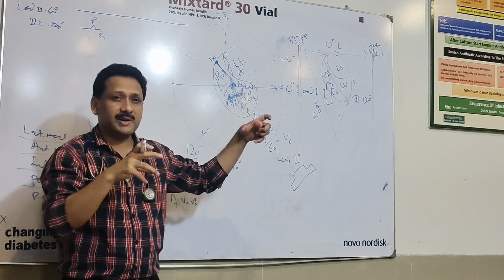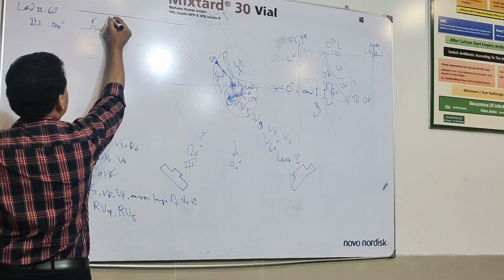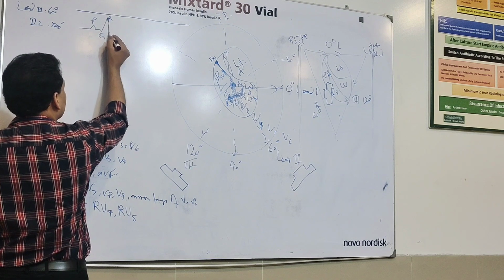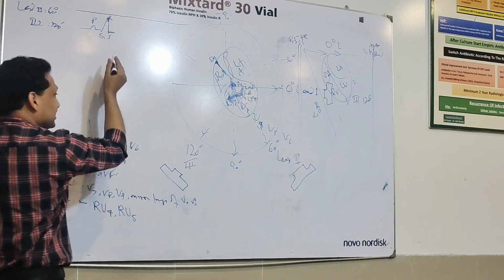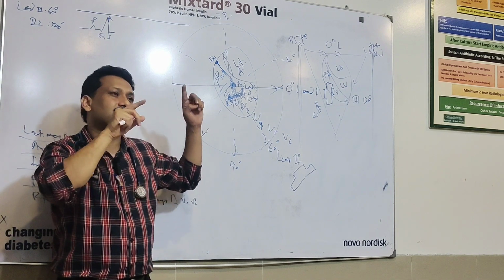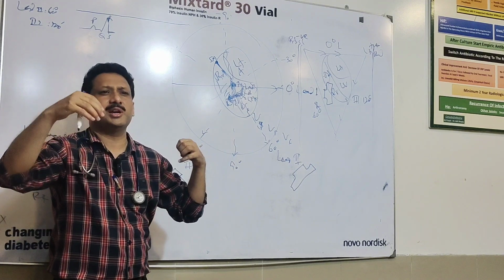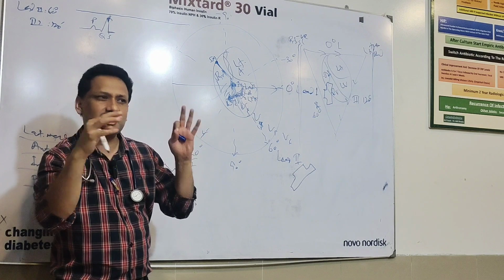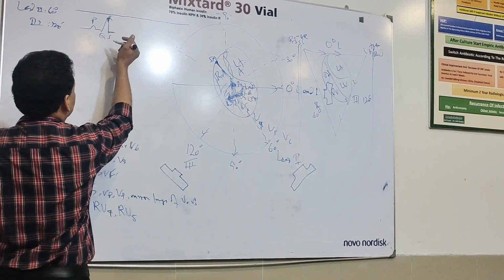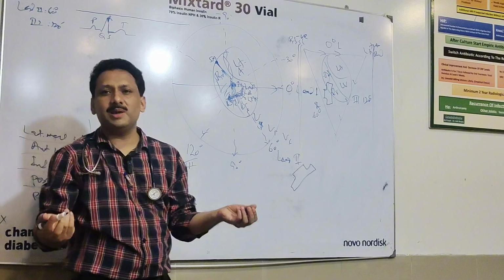As these are big size ventricles, the deflection is also big, and you see this wave, known as the R wave. As this wave comes back to the baseline, we call it the S wave. Ventricular depolarization happens as the channels open, sodium, potassium, calcium influx, you understand about those channels. So these channels open, depolarization is done, and ultimately they repolarize. Then there is ventricular repolarization, and this is known as the T wave. This is what happens in normal human beings.